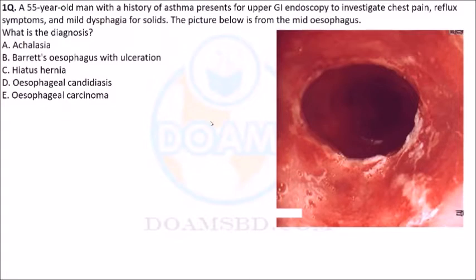Shahriar, ready? I'm just giving some clue only, not the answer. There is a reflux in the picture. So both maybe the two key areas to be addressed. Dr. Shahriar is ready to give the answer, please. I think it is Barrett's esophagus with some ulceration.